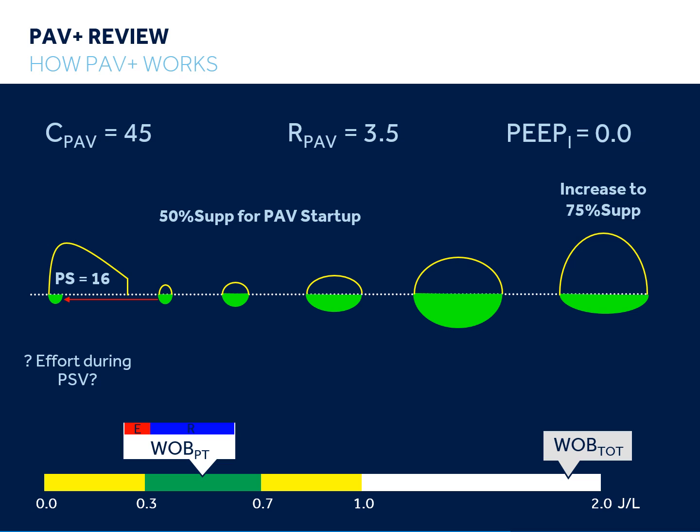It's important to recognize that if a patient has significant atrophy, exhaustion, or diaphragm injury due to non-normal work of breathing levels previously, the patient may not be able to tolerate even a normal work of breathing for an extended period of time. In such cases, it may be necessary to rest the patient at below normal levels of work between attempts to normalize their work of breathing.